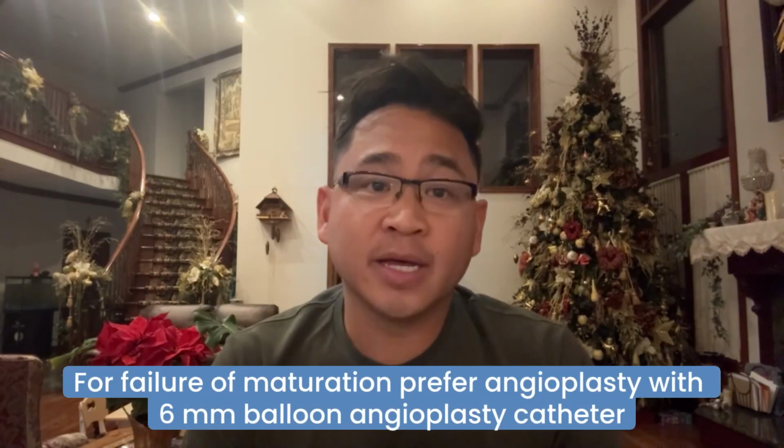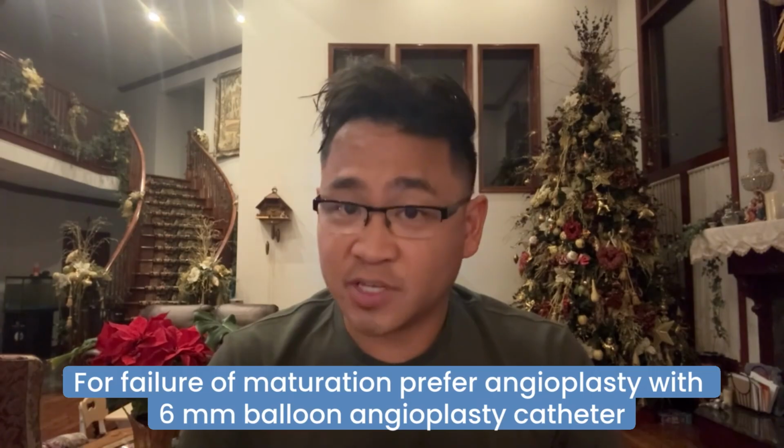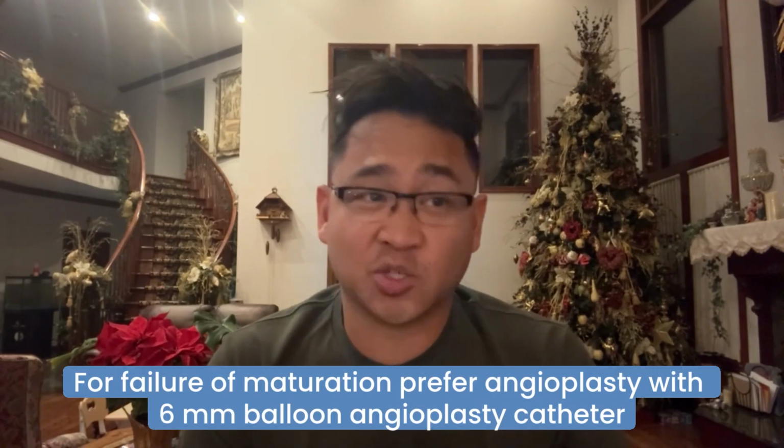How does it change your approach? If you see the non-mature fistula, do you send them back to a surgeon or is there something you could do? So typically, what we would do is dilate, and it's called angioplasty, balloon the vessels to a normal size. So if you use the rule of sixes again, you want to preferably go up to a 6 millimeter balloon as your goal to dilate those narrowed portions of the fistula to a good size, usually about 6 millimeters, because that's sort of the starting diameter for a functioning fistula. And then when you get preferential flow through the mainline fistula, oftentimes those vessels that are stealing blood away from the fistula itself resolve.